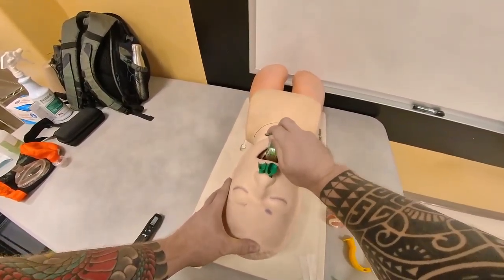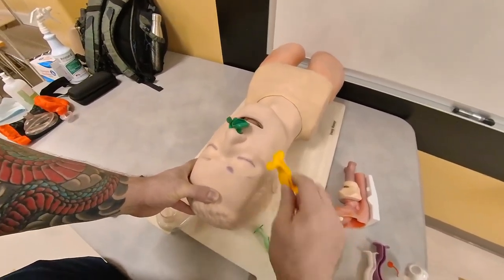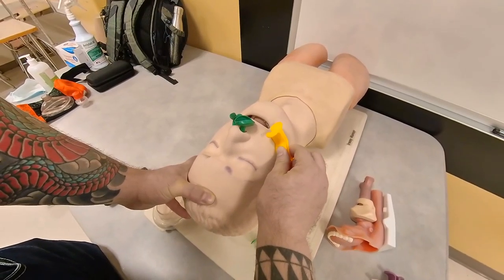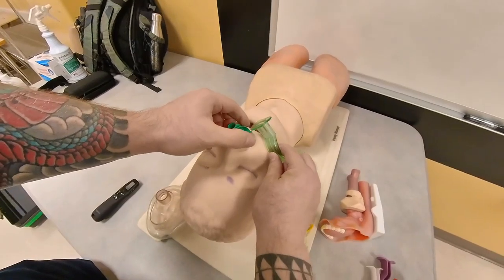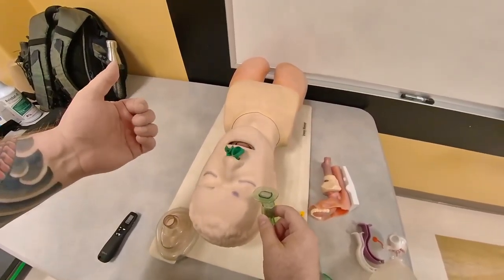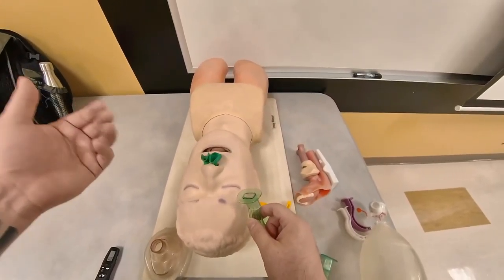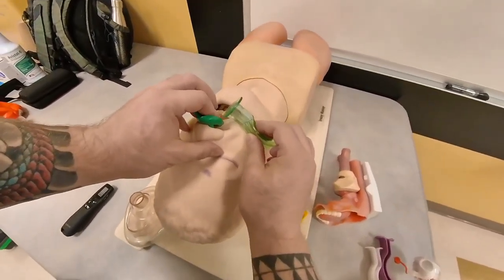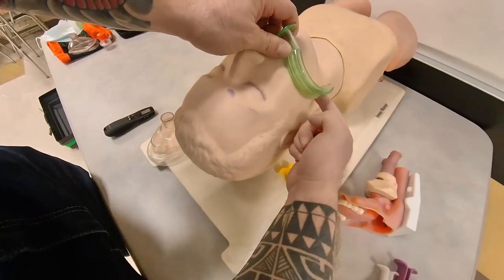Now, how to size the OPA. Oftentimes you hear to size the OPA from the corner of the mouth to the angle of the jaw. I'm going to show you a study that tested this technique versus sizing from the central incisors to the angle of the mandible. From the central incisors to the angle of the mandible, they found on average six to eight percent of patients had better ventilatory effort. So the way you should be sizing the OPA is from the central incisors — the central teeth of the patient — to the angle of the jaw.